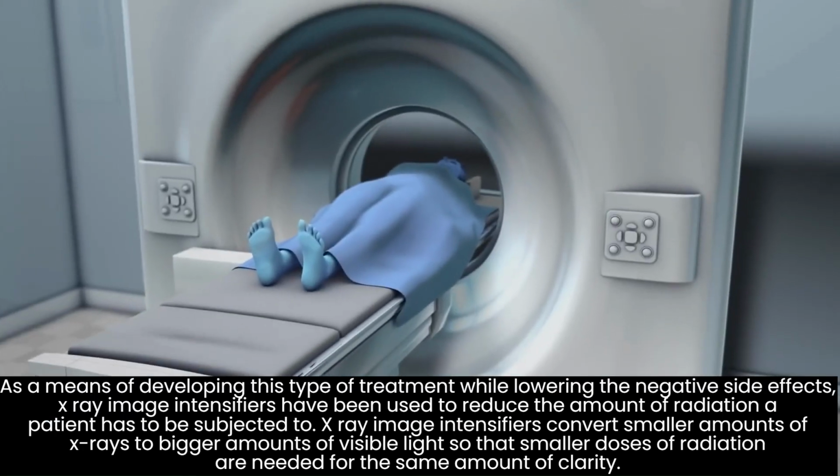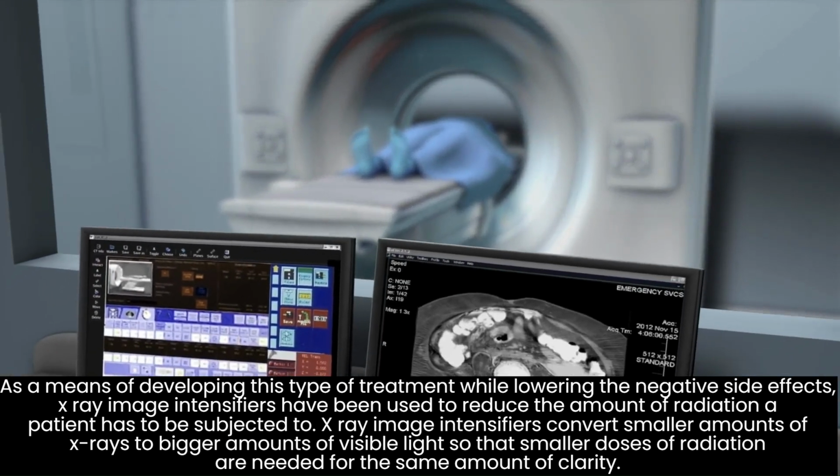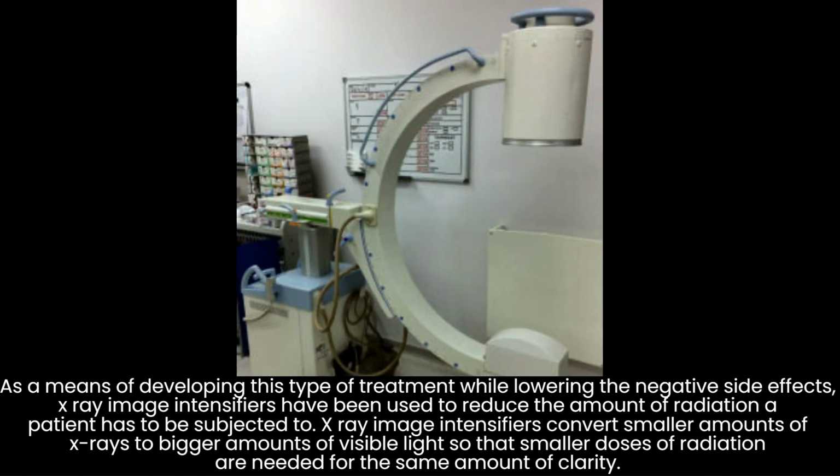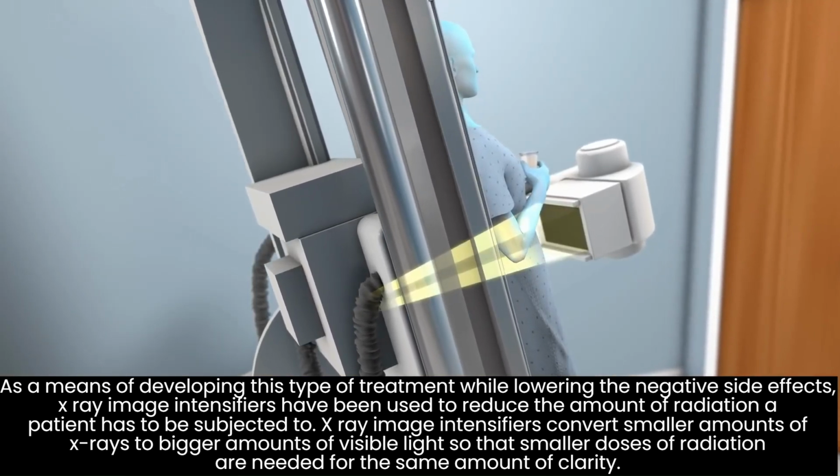As a means of developing this type of treatment while lowering the negative side effects, X-ray image intensifiers have been used to reduce the amount of radiation a patient has to be subjected to. X-ray image intensifiers convert small amounts of X-rays to bigger amounts of visible light so that smaller doses of radiation are needed for the same amount of clarity.